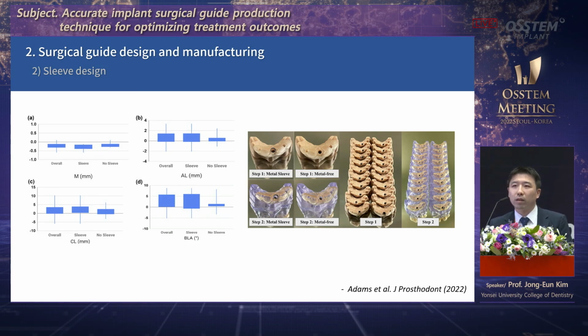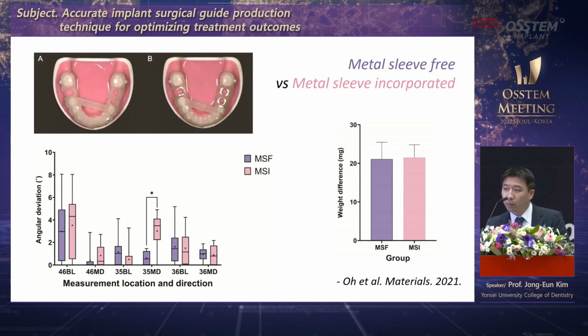If you look at the recent studies here, metal sleeve or lack of, there's no meaningful difference. Sometimes the ones without metal sleeve led to better result. You don't need to be concerned about metal sleeves or lack thereof.